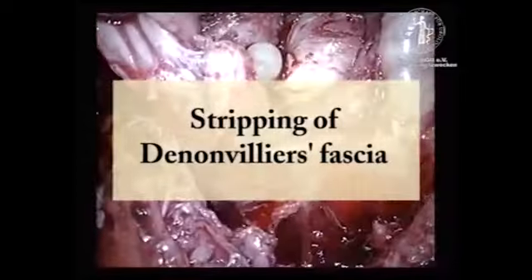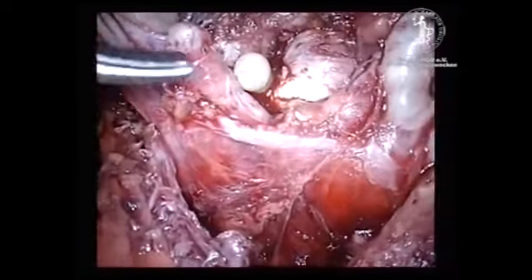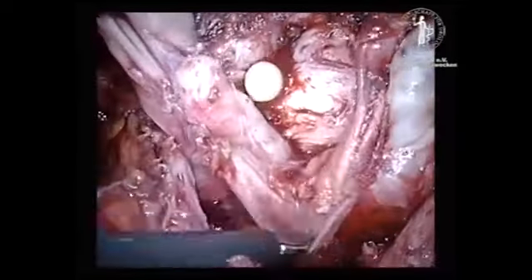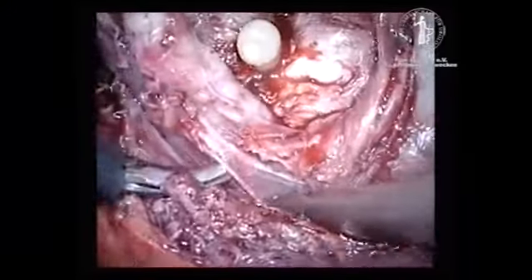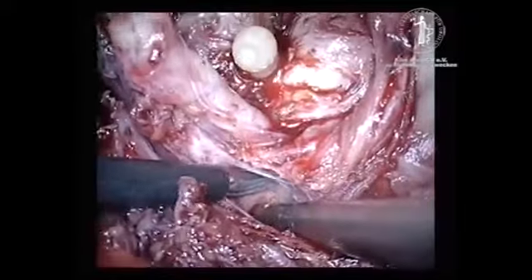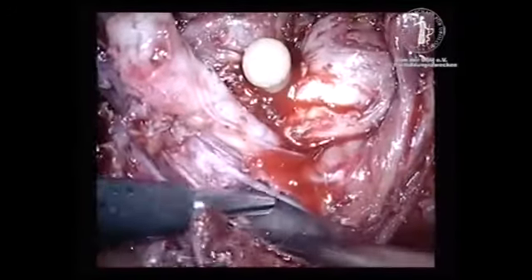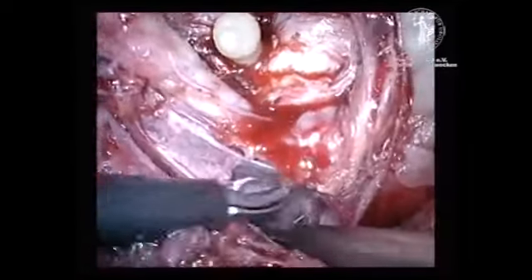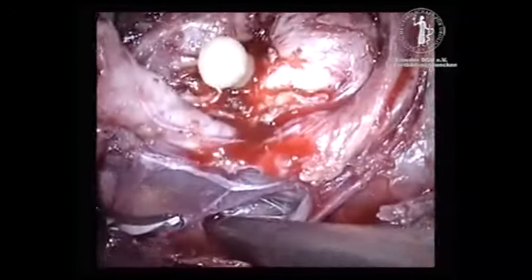After completion of seminal vesicle dissection, both the surgeon and the assistant retract the seminal vesicles in a craniolateral direction, exposing Denonvillier's fascia. In contrast to standard nerve-sparing prostatectomy, the fascia is not incised. The appropriate plane of intrafascial dissection can be found by stripping down the Denonvillier's fascia from the prostatic capsule. The dissection is continued strictly in the midline as far as possible towards the apex of the prostate.